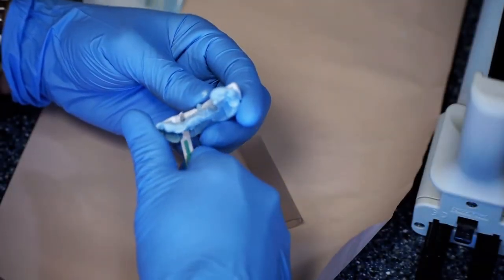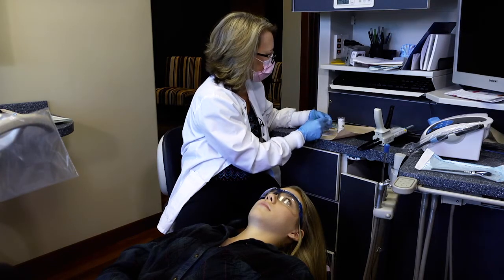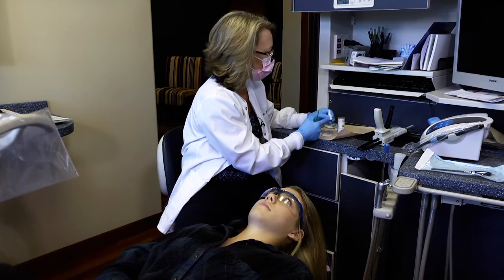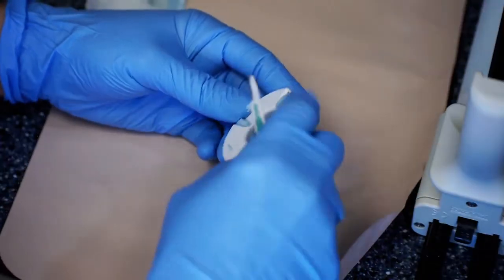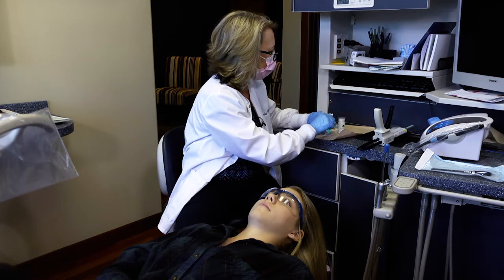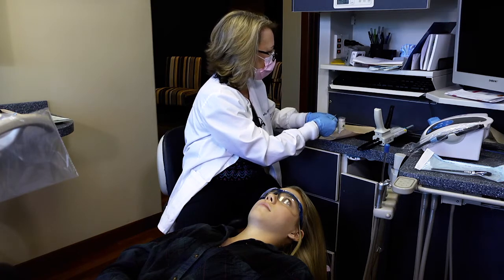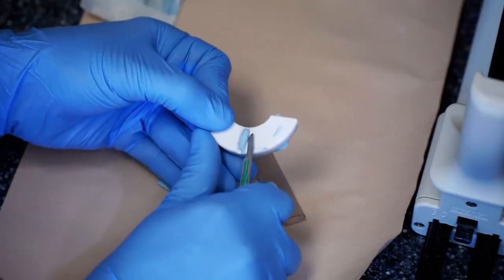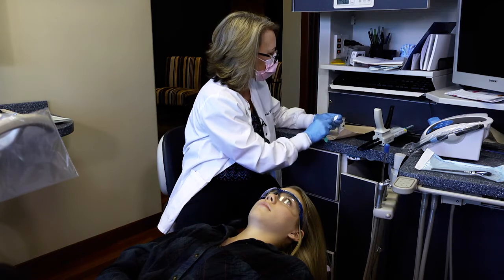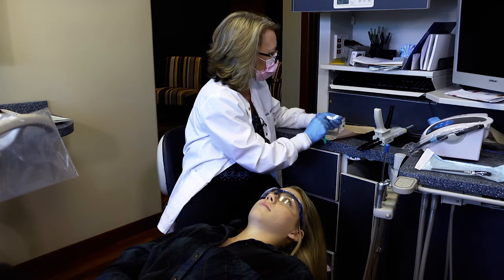I'm trimming off the excess on the lingual of the quick splint — not shortening it, but making it flush with the white plastic so it's not an irritant to Jenna's tongue. I'm not shortening it because it helps with retention. I also trim it flush on the distal, using the quick splint itself as the guide for where I want to trim the bite registration. In the anterior at the midline, I want it trimmed flush but I won't dig it out, as it helps hold the bite registration. I'll use my finger or the blade to make sure it's nice and smooth.